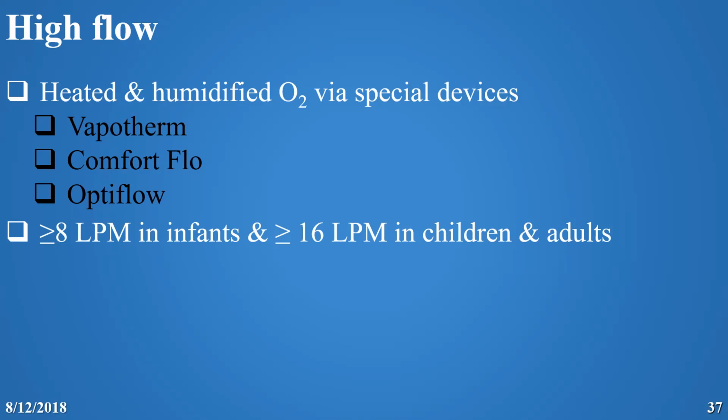When we give high flow, the principles are heated, humidified, and blended. Blending means the flow comes from the air and the oxygen percentage as we need.